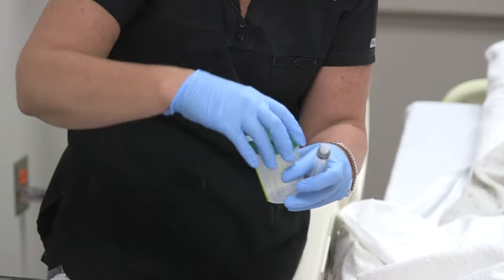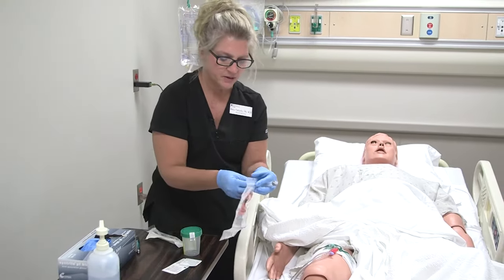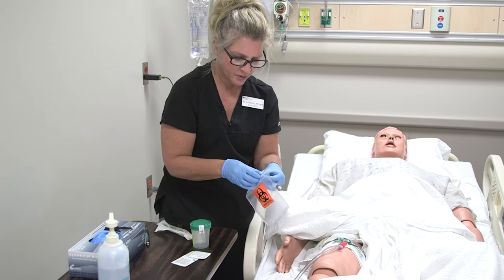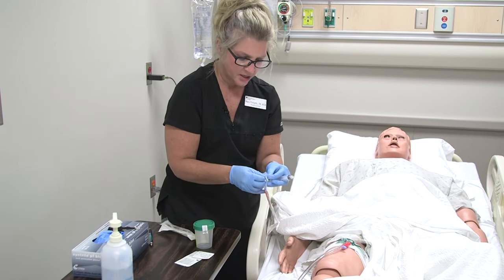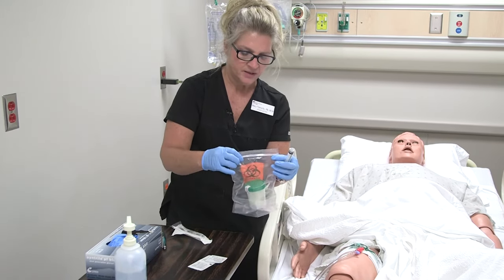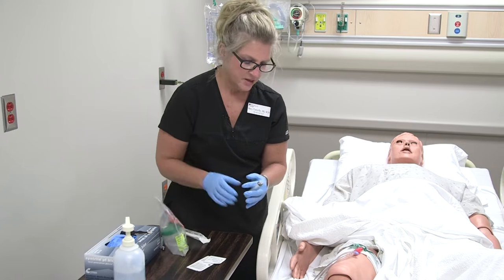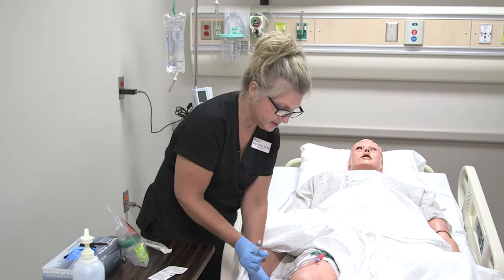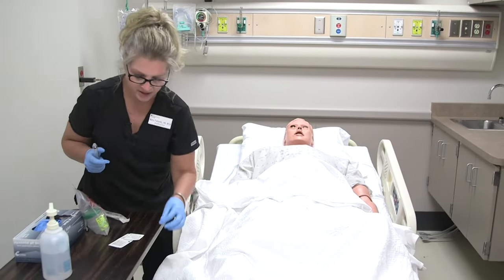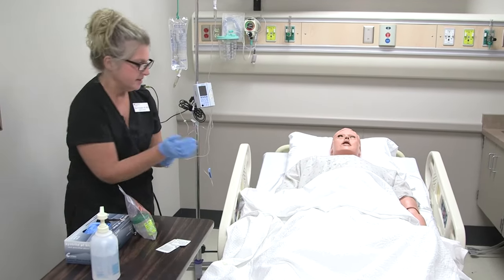Go ahead and put the cap on, keeping the sterility of the container. Then place it in your biohazard bag. I didn't really touch any urine, so I'm okay with my gloves, but if my gloves got contaminated I would want to change those. This is now in my biohazard bag and ready to go. I'll tell the patient I'm done — I'm going to unclamp the tubing and cover him back up, discard our garbage, and make sure he is safe and comfortable.